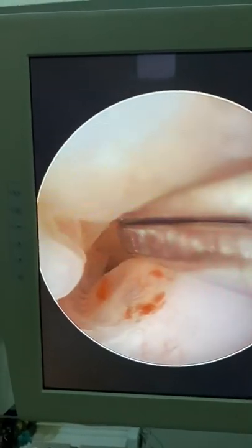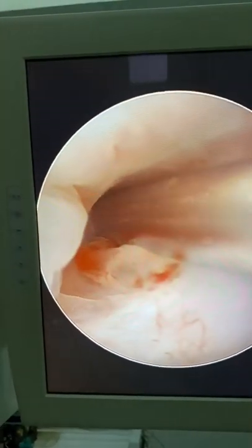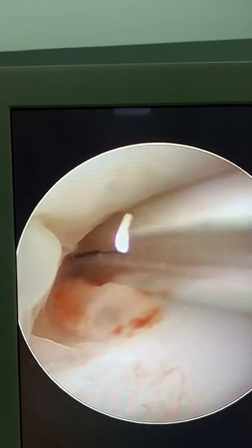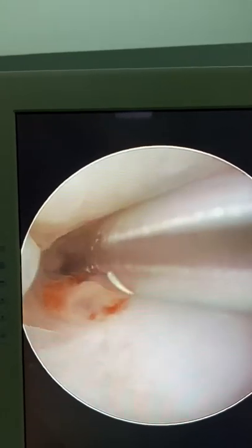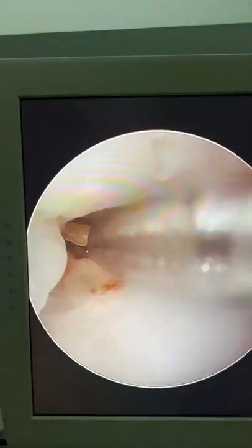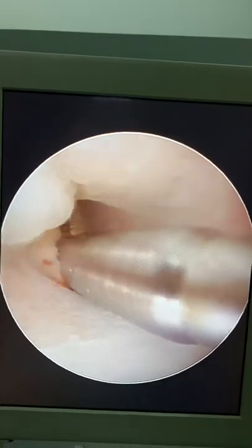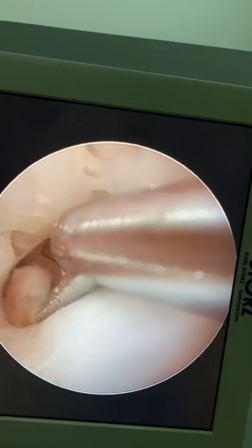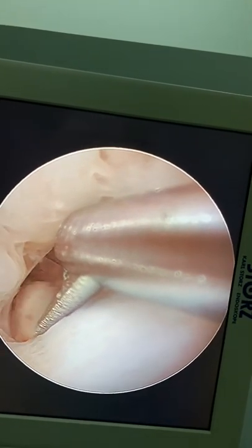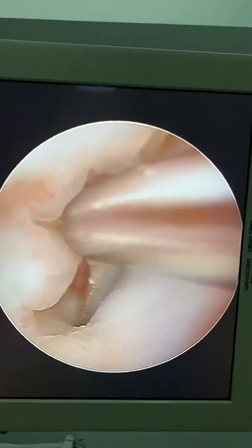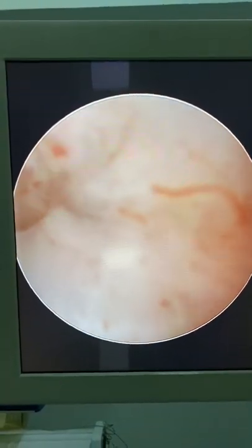Push towards that side — there is a cavity in this direction. I'm trying to dilate the internal os under vision. You can see the internal os is getting a little bit more dilated. Use the jaws of the scissors to dilate the internal os — this is much better than the blind Hegar dilators. Shall I go in now? Okay, gliding in.